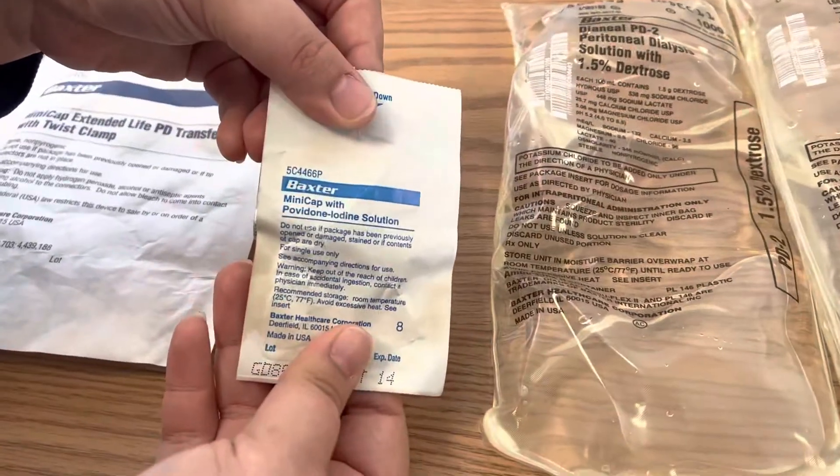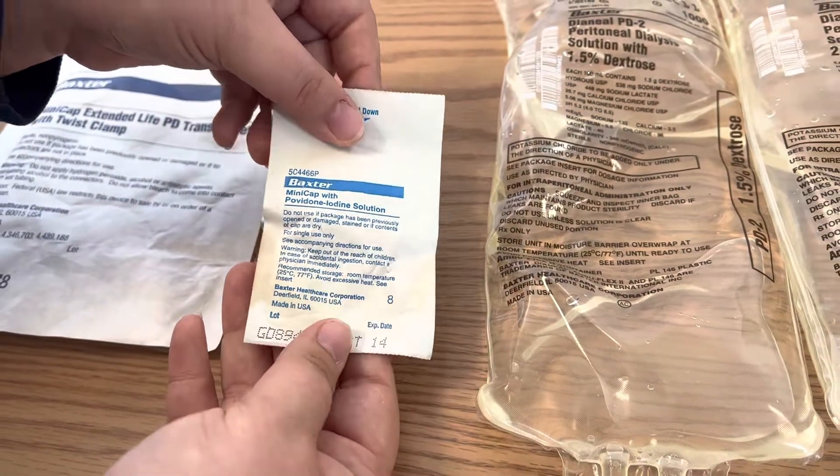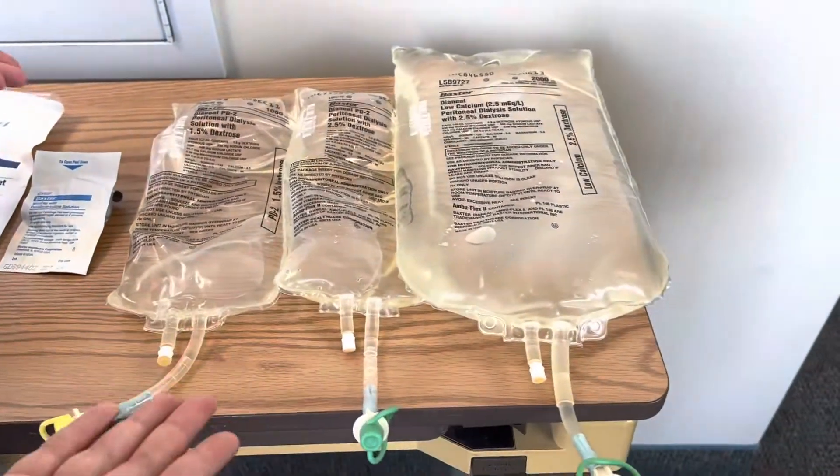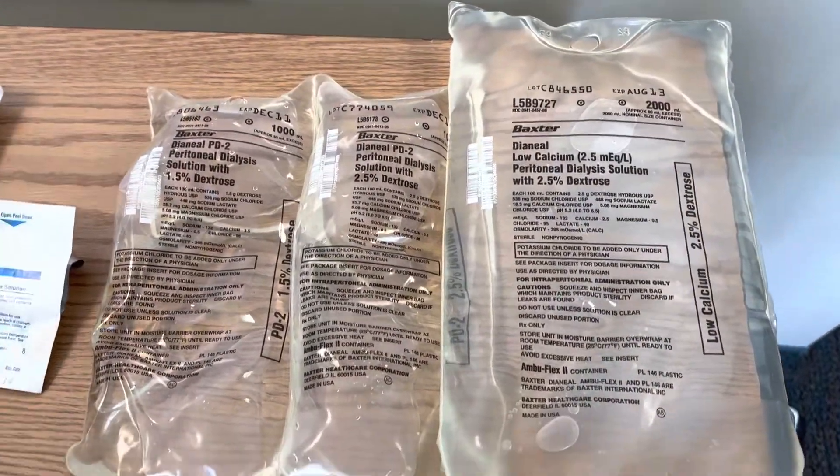You're also going to need lots of these mini caps with the povidone iodine solution in them, and then of course you're going to need your peritoneal dialysis solutions that we're going to be instilling.